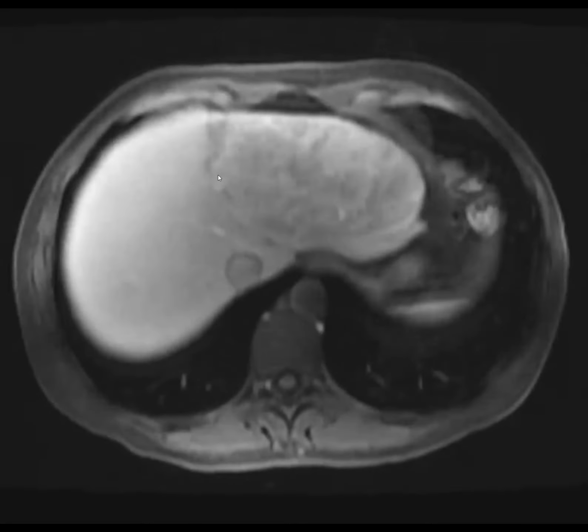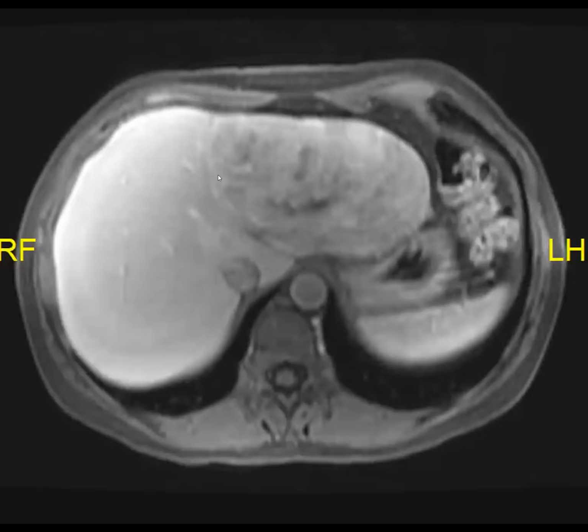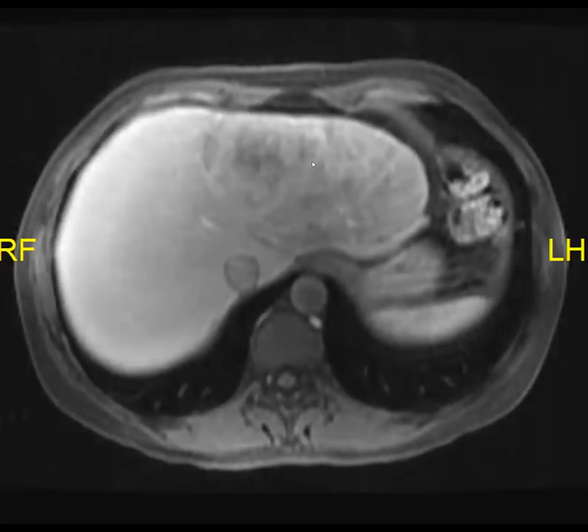Interesting. If we think that there's a substantial chance of malignancy, then they just take it out. Yeah, I would say they probably would have all gotten biopsied here, to be honest, because I've seen FNHs that are massive and also have atypical features. Some FNHs have a little bit of washout, some can have fat, some can have heterogeneity. So we know that FNHs can be atypical, and I wouldn't want to lose half my liver because of an FNH. I think that a biopsy would not be that invasive.